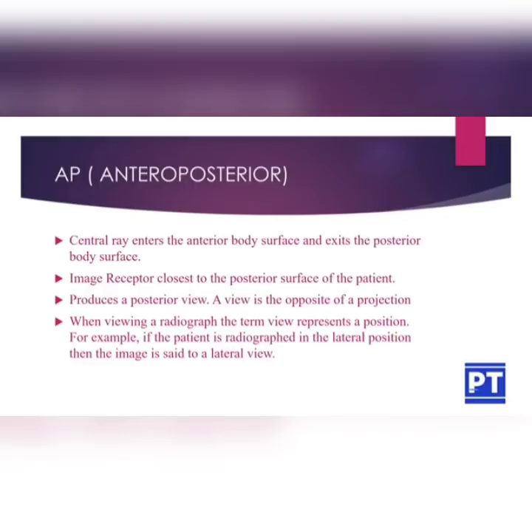A view is the opposite of a projection. When viewing a radiograph, the term view represents a position. For example, if the patient is radiographed in the lateral position, then the image is said to be a lateral view.